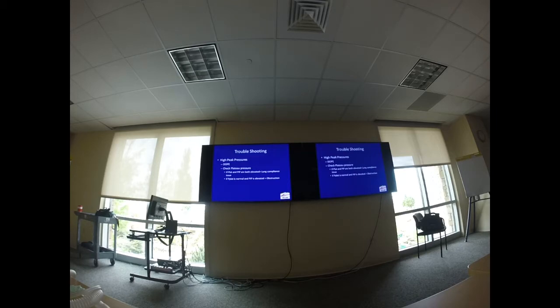So like what Mark said, it's a stiff lung. So if they're both high, right? So my P-plat is greater than 30 and my PIP is greater than 40, they're both elevated, then I'm thinking I've got a compliance issue, I've got a stiff lung. So maybe he's a burn patient or he's an ARDS patient or something like that.